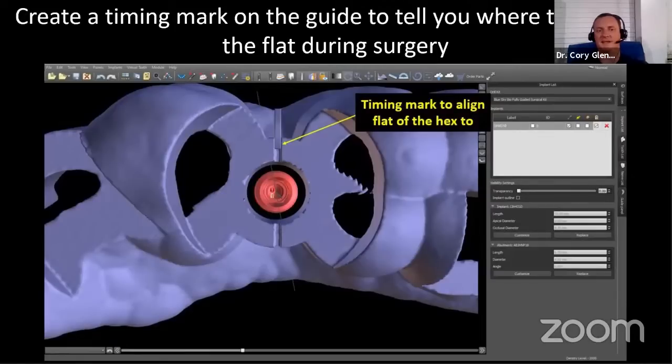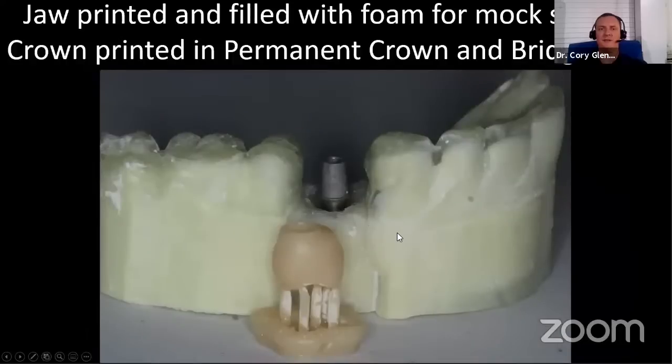I'll just turn the text emboss on and create a little I right on the guide, like the letter I, and that will create you a timing mark. So again, when we go into surgery, the driver has six lines for each of your flats. Make sure you put a flat right to that line, and then everything should line up.